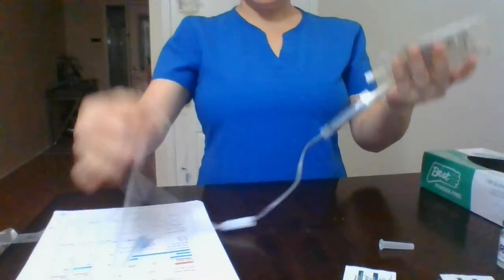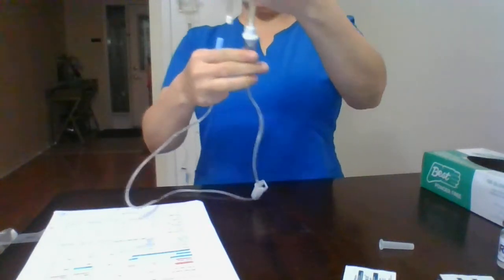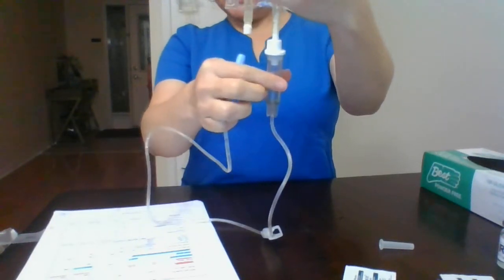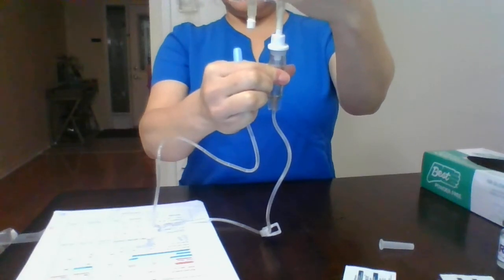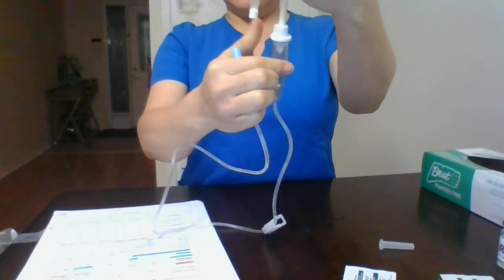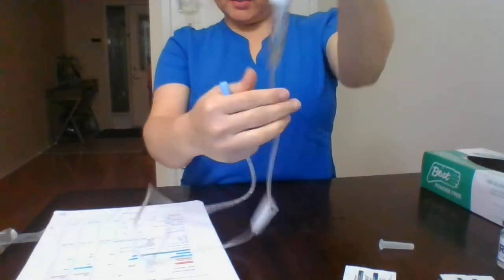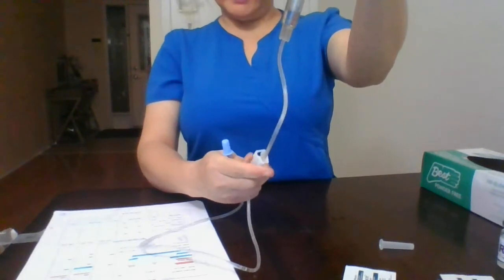And before we attach our mini IV, I will make sure that I don't have any air. So what I will do is gently press, and now we see that we have some medication. So what I will do is gently open the clamp.